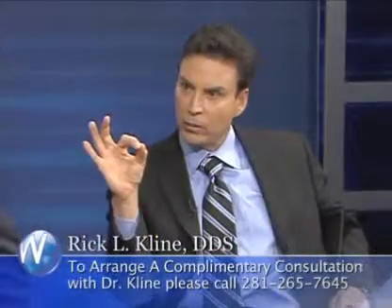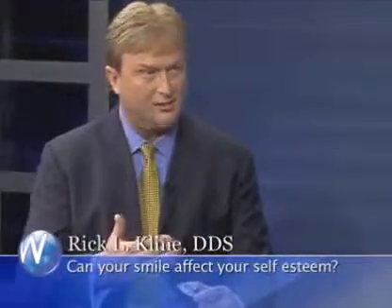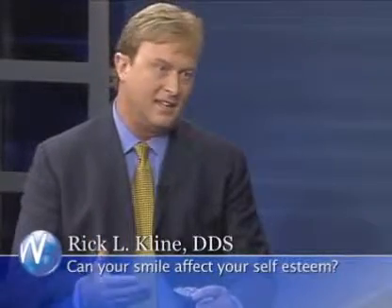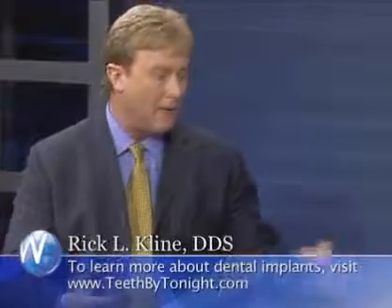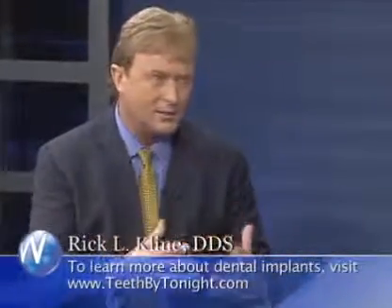And that's new. I mean, that's fairly new. That's very new. Not a lot of guys doing it? Not a lot. I've been doing it for several years because I was part of the inception. So you teach that procedure? I teach this to dentists, yes. So what do you call it? Like flapless? You're not cutting. It's a no flap, no incision dental implant placement. So it's called guided surgeries.